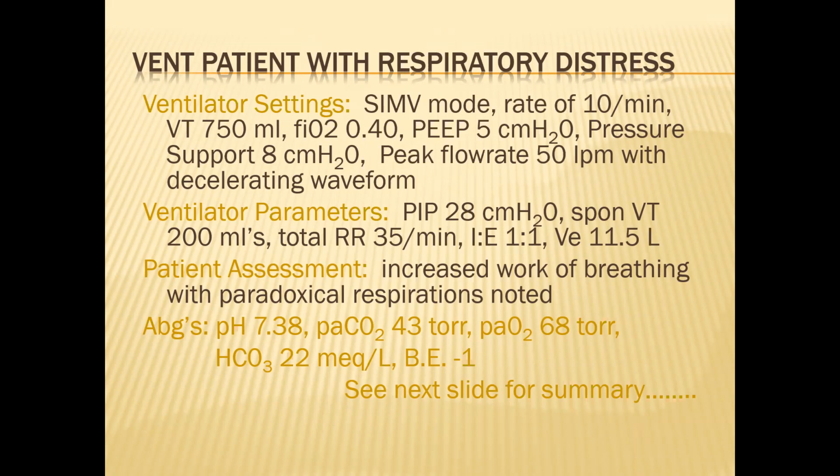Like what's their blood pressure? There are certain things that you can affect. So I probably would try 0.5 FiO2 first and see if it's good. Okay, anybody else?